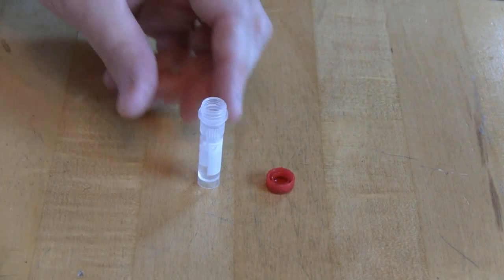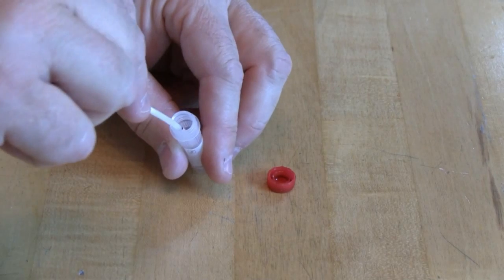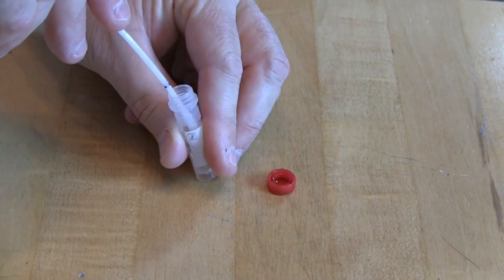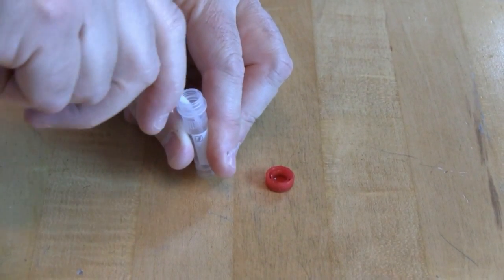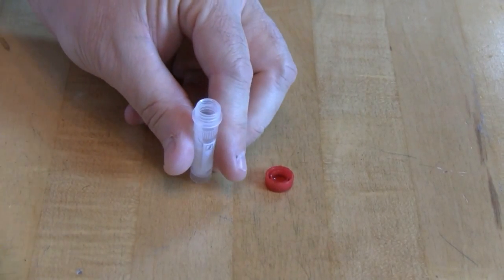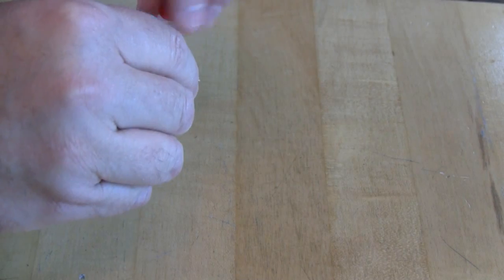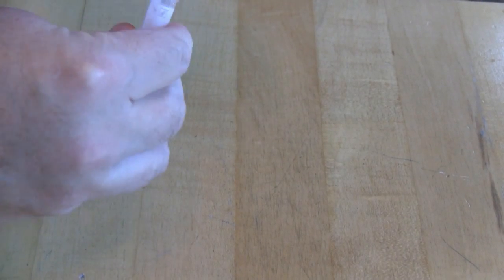Let's take a look at that swab snap again from a different angle. Place the swab in there to about where it's at the black line, now bend it until it snaps like that. Now replace the lid on the vial, make sure it's secure, and give it a little shake.